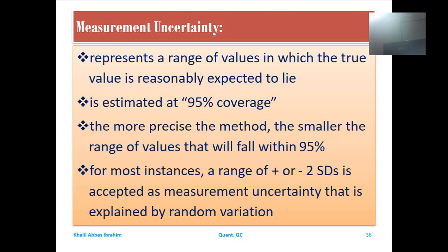Measurement of uncertainty is estimated at 95% coverage, as we said before, because 95% of the values obtained by consecutive and repeated examination of the control materials are covered.